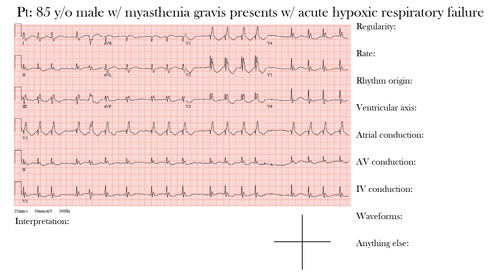Then we'll look at the rhythm origin — is it originating from within the atria, the AV node, or the ventricles? Next we find the ventricular or QRS axis, which helps with our differential diagnosis. Then we assess atrial, atrioventricular, and intraventricular conduction — is conduction within all of these normal or abnormal? We'll also look at the waveforms, which includes all waves, segments, and intervals, and finally anything else we may have missed.